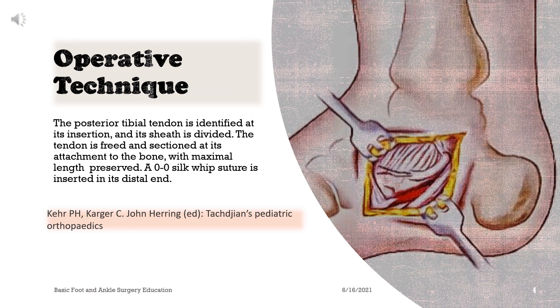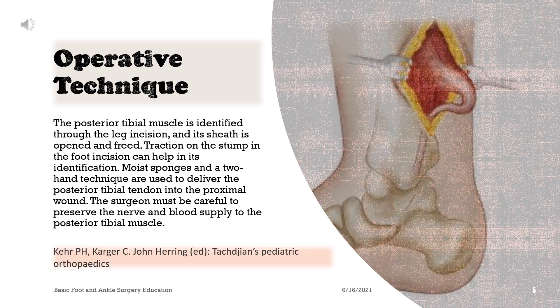The posterior tibial tendon is identified at its insertion and its sheath is divided. The tendon is freed and sectioned at its attachment to the bone with maximal length preserved. A 0-0 silk whip suture is inserted in its distal end. The posterior tibial muscle is identified through the leg incision and its sheath is opened and freed. Traction on the stump in the foot incision can help in its identification. Moist sponges and a two-hand technique are used to deliver the posterior tibial tendon into the proximal wound. The surgeon must be careful to preserve the nerve and blood supply to the posterior tibial muscle.